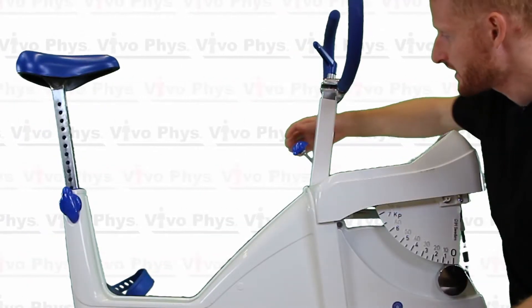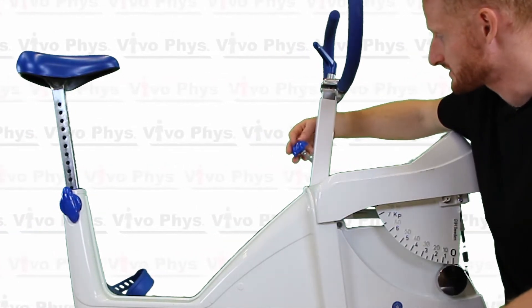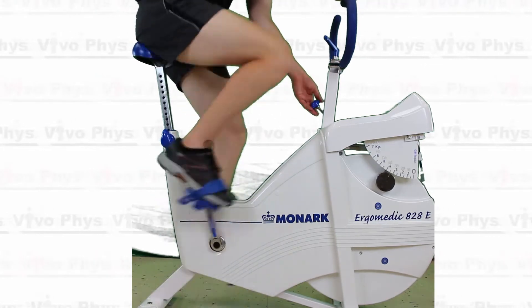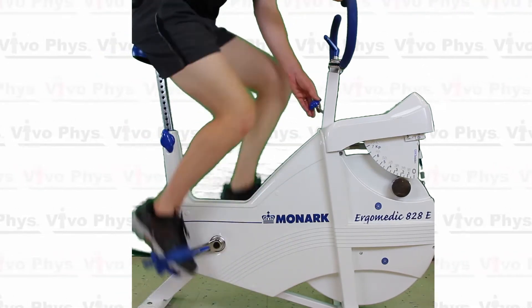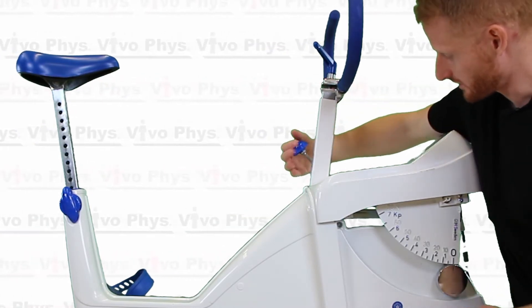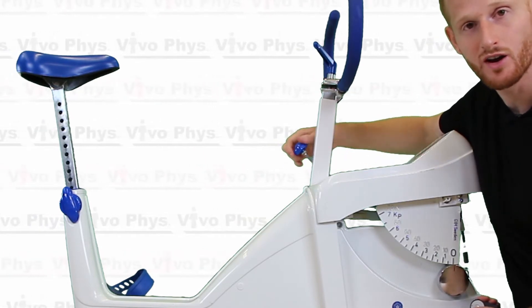To adjust the resistance on this bike, it's this blue knob here that's going to be facing the participant. Essentially if you just turn it to the right, it gets harder. If you turn it to the left, it gets less challenging. When you're doing this, the person has to be cycling. If I'm turning this knob now, you're going to notice this pendulum doesn't move at all.